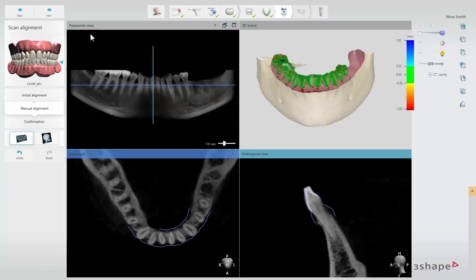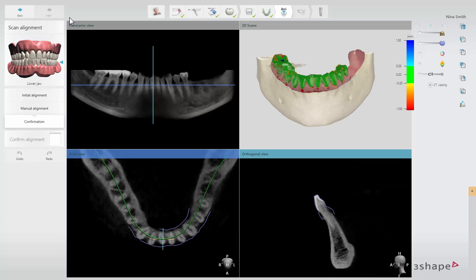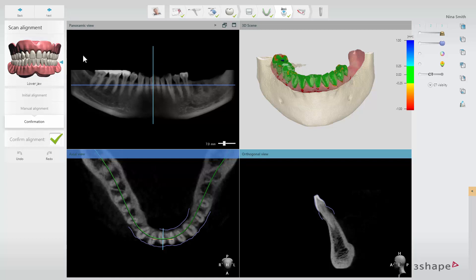Once you are satisfied with the alignment click Next to move to the confirmation step. Here you simply confirm the alignment by checking the confirm alignment box. Click Next to proceed to the nerve definition step.